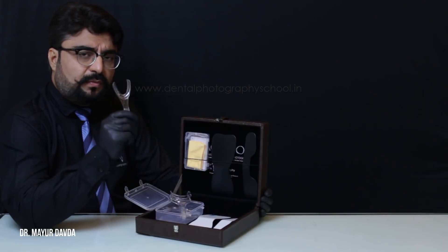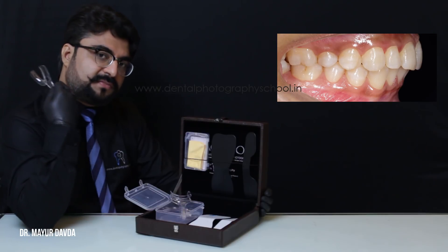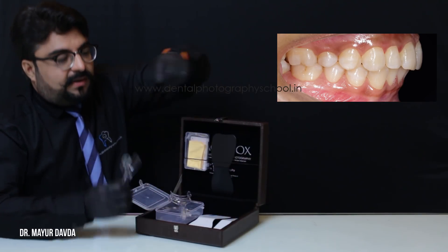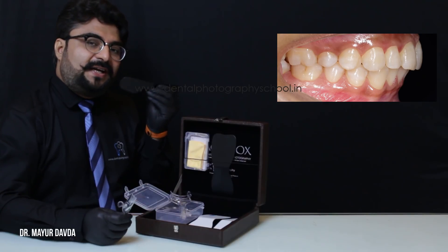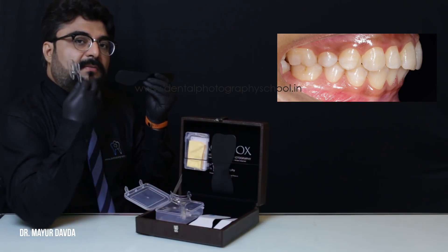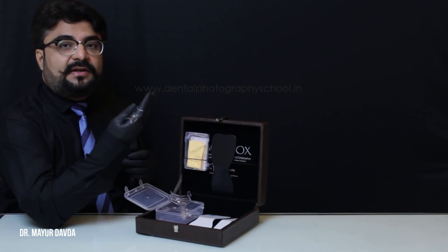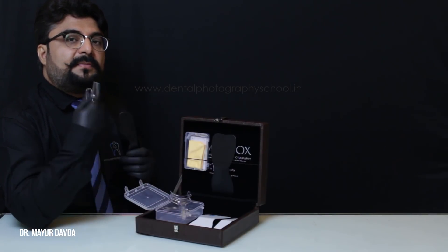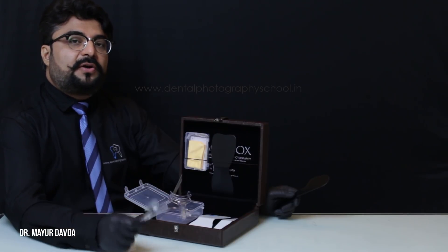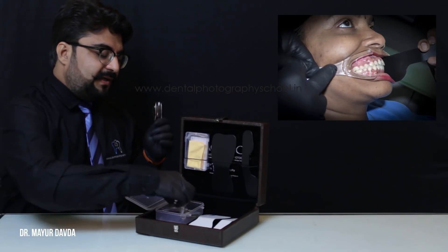We use the V-shape cheek retractor whenever we are documenting the molar relations or the canine relations. For example, if I'm recording the right side, I use this on the right side and I use the sectional contrastor on the contralateral side so that, in addition to good retraction, I also get a black background in front of the anteriors — giving quite an aesthetic result. You can use this for canine guidance as well.